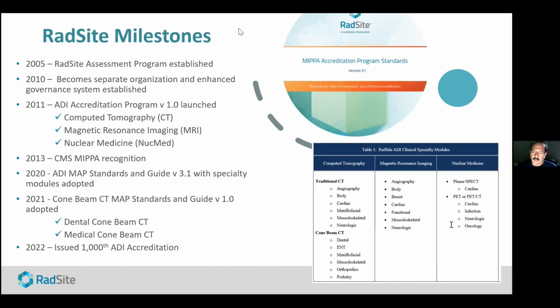So if one is looking at really fine detail for dental applications or orthopedic or maxillofacial or other applications that require a very high resolution, cone beam CT is particularly well suited for that, given the very high spatial resolution of each of the images that are obtained by cone beam CT.